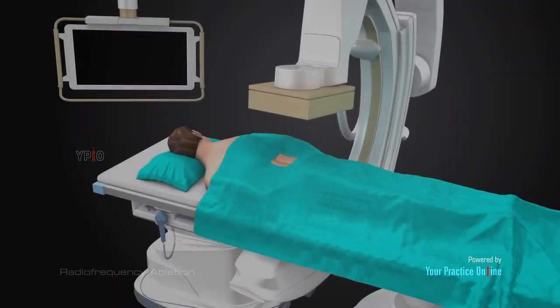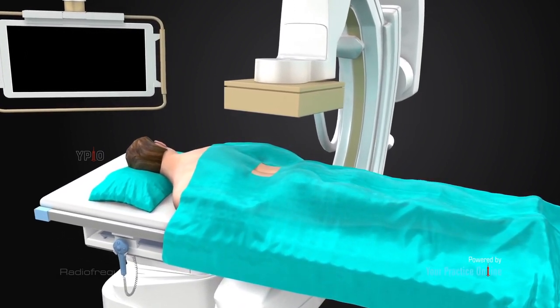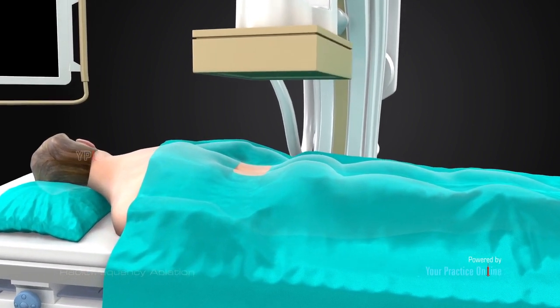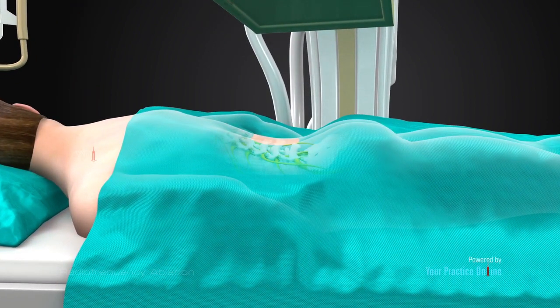Procedure: radiofrequency ablation is a minimally invasive technique, and therefore administration of general anesthesia is not required. You will be conscious throughout the procedure while lying on your stomach. Only a small area over your back or neck, which requires treatment, is cleansed and numbed.